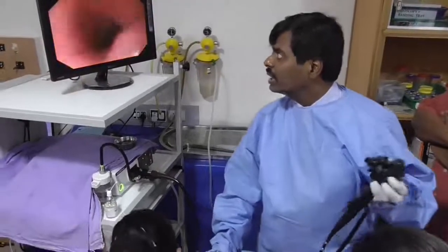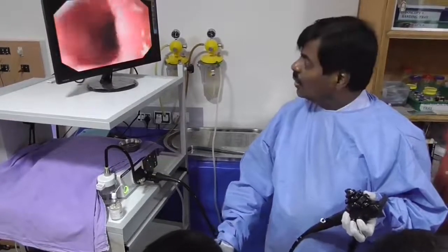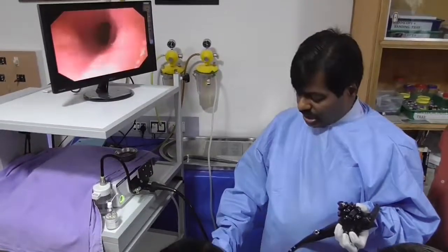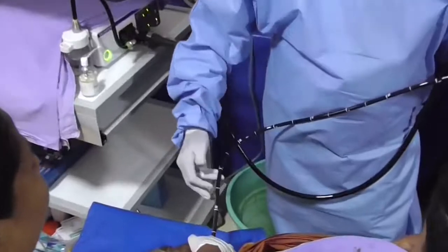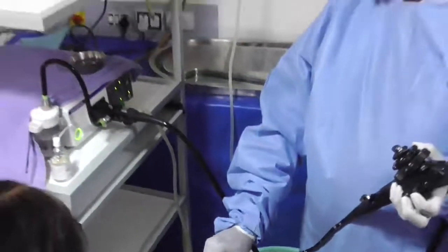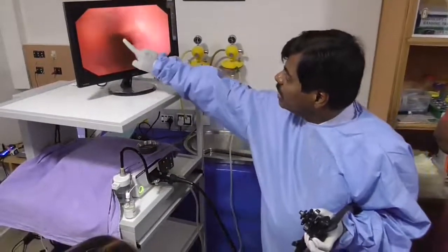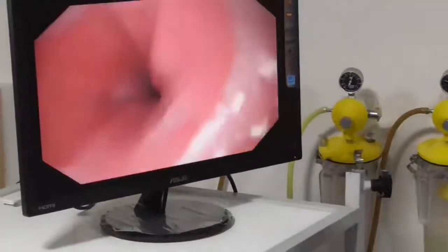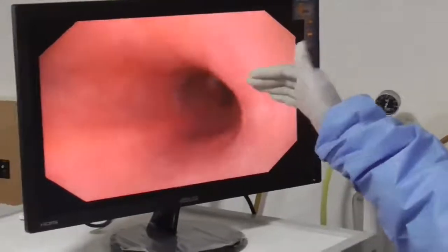You will then be entering the esophagus beyond the cricopharyngeus. The three important level numbers in the esophagus are 15, 25, and 40 centimeters. At 25 centimeters you may see the left bronchus causing an impression — you can see a faint depression in this patient due to the bronchus. In a thin patient it will be much more prominent. At 12 o'clock is the anterior wall of the esophagus, where pulsation of the left atrium can sometimes be seen as transmitted pulsation.